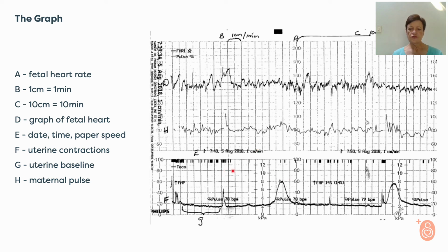This part is the uterine contraction part, as I've said. And here we can see the uterus relax, and then the uterus contracts, and there's a contraction, relax, and contraction again.